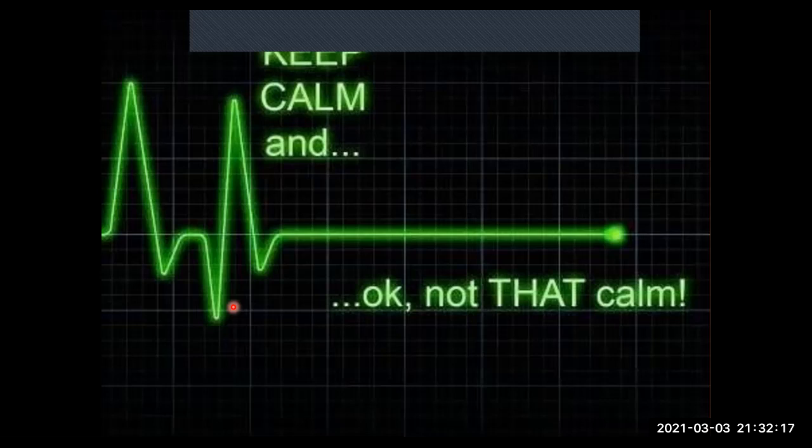And yeah, what we're going to do is then we're going to cover rate as the next one.